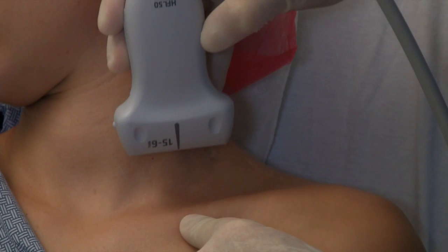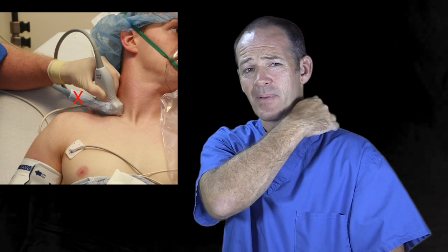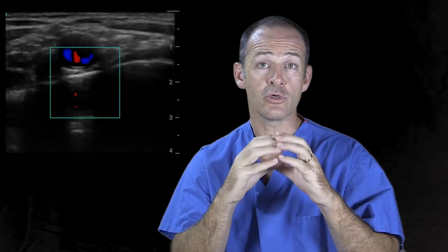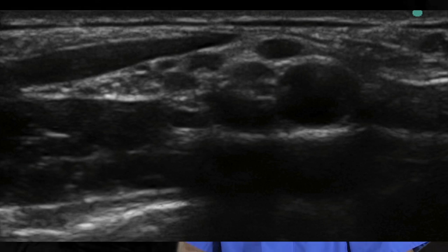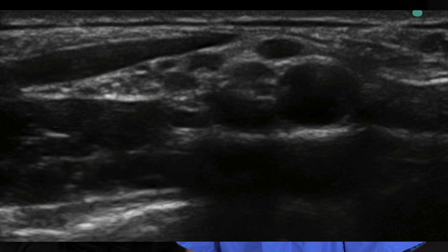Place the probe behind the midpoint of the clavicle, aimed acutely down the neck — the probe should look almost vertical, as we're imaging deep into the thorax. Don't aim the probe flat across the neck or you won't see the subclavian artery. Locate that pulsatile subclavian artery first — it appears hypoechoic, looking dark, and sits right on the bright hyperechoic line of the first rib or the pleura.